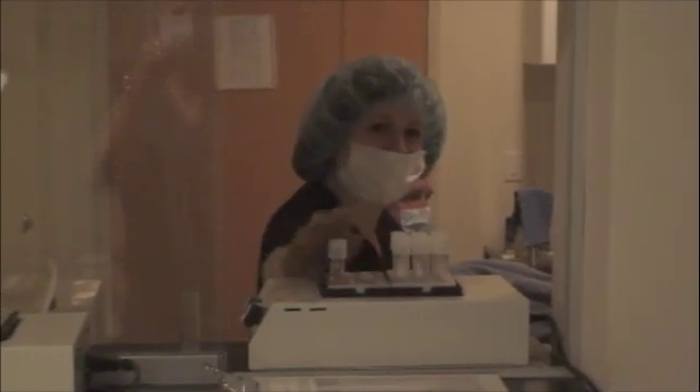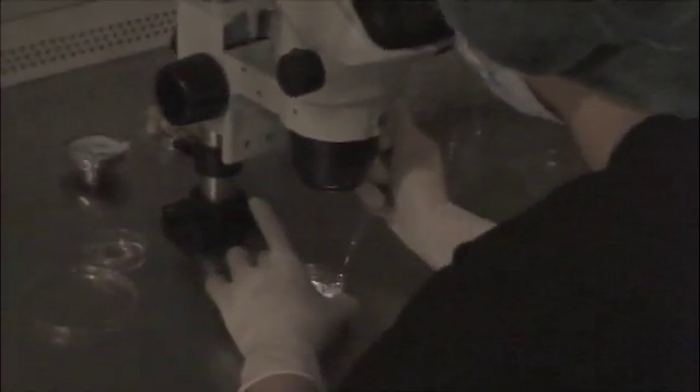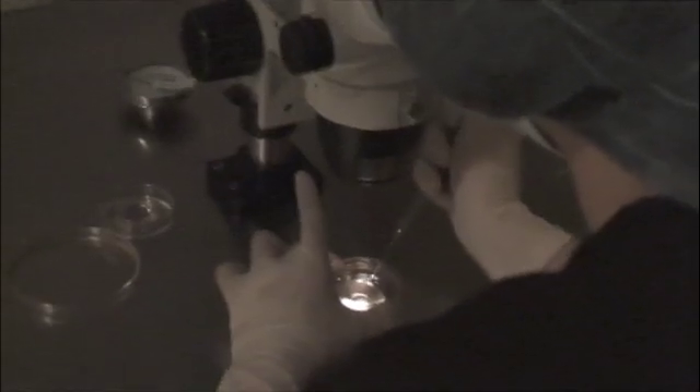Here is a view from within the IVF laboratory on the other side of the window. While the egg retrieval is being performed, the test tubes that are full of follicular fluid are passed to the embryologist through this space.